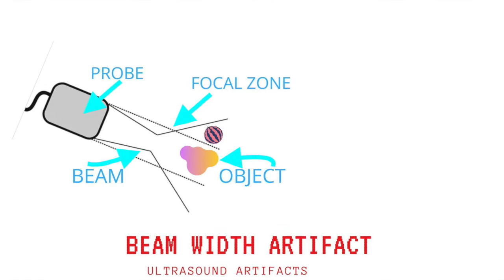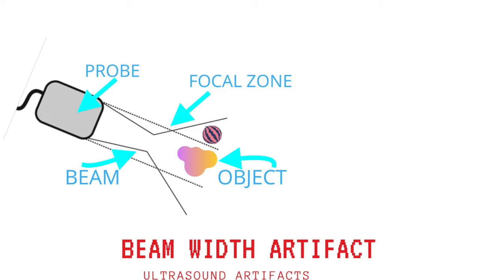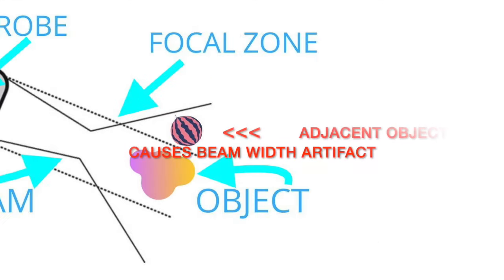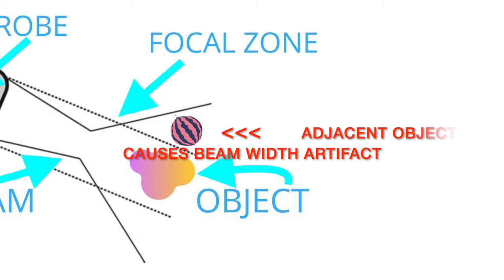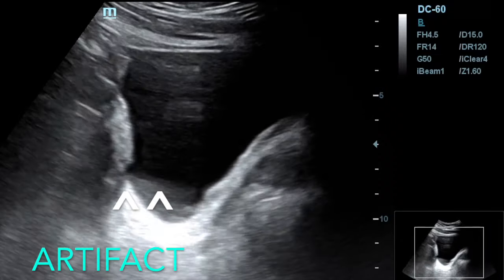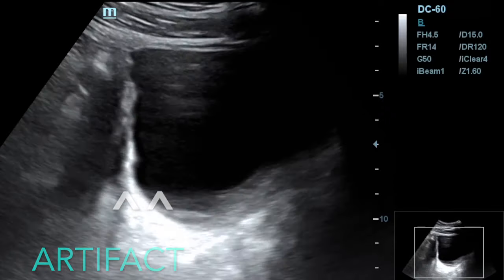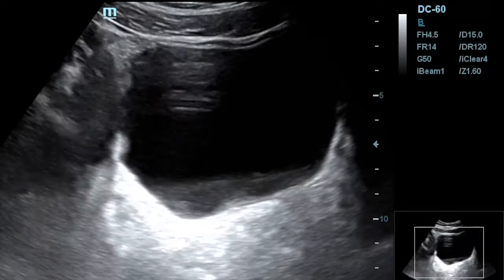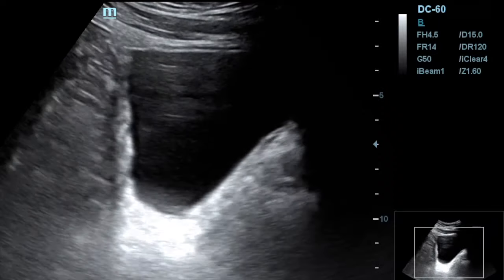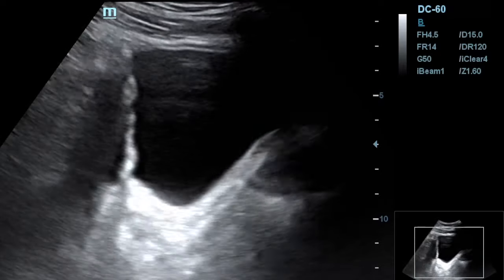This distal beam may widen beyond the actual width of the transducer, causing the beam width artifact. If a highly reflective object is located within this widened beam beyond the margin of the transducer, it can generate echoes — most commonly seen around the urinary bladder. We recognize beam width artifacts when a structure that should be completely anechoic, like the bladder, contains peripheral echoes along its posterior aspect. We can reduce this artifact by adjusting the focal zone down to the level of interest.